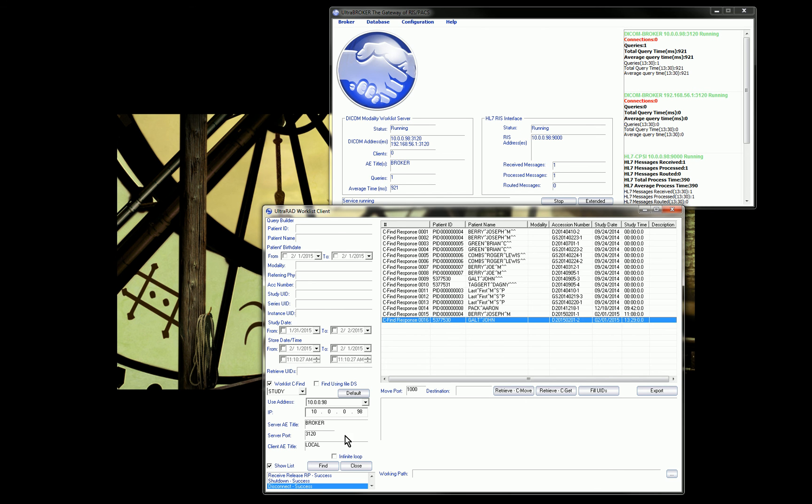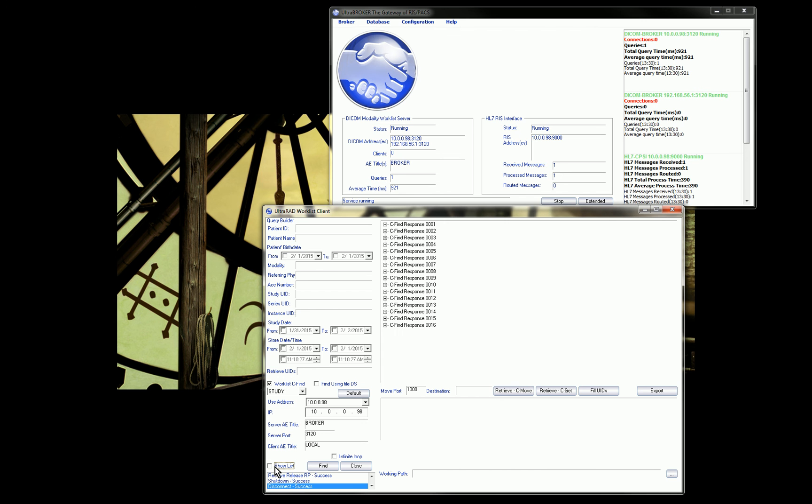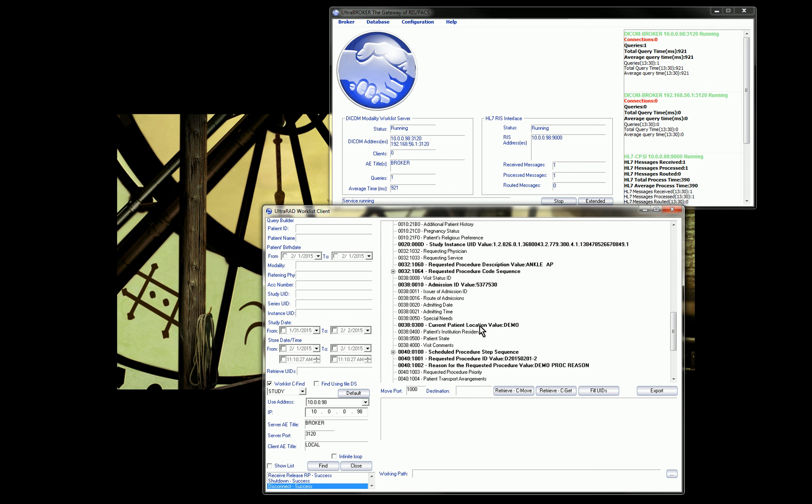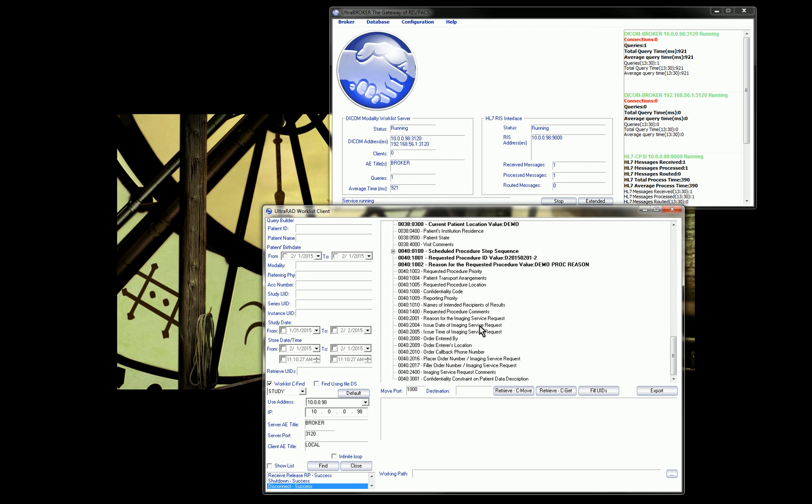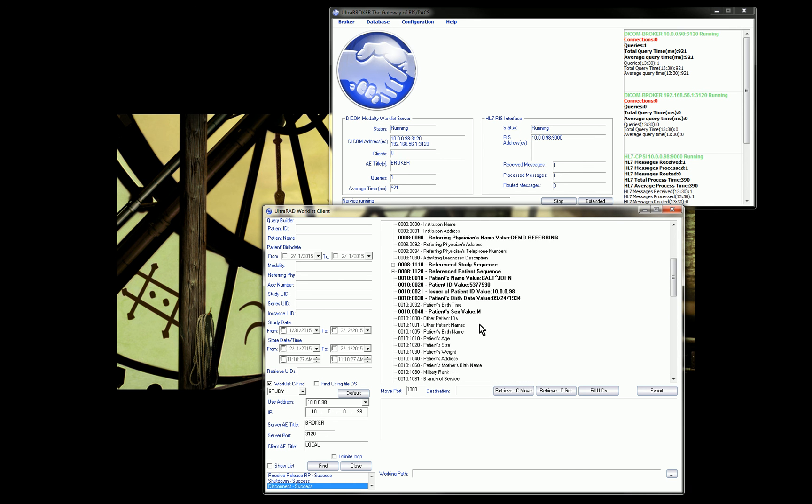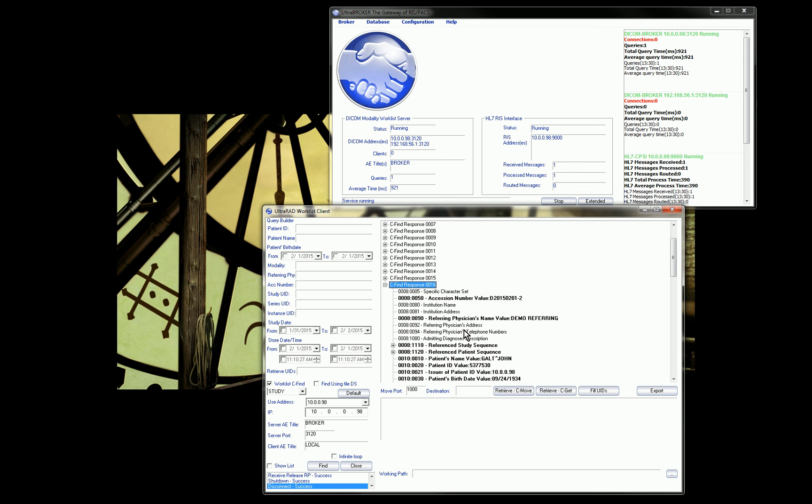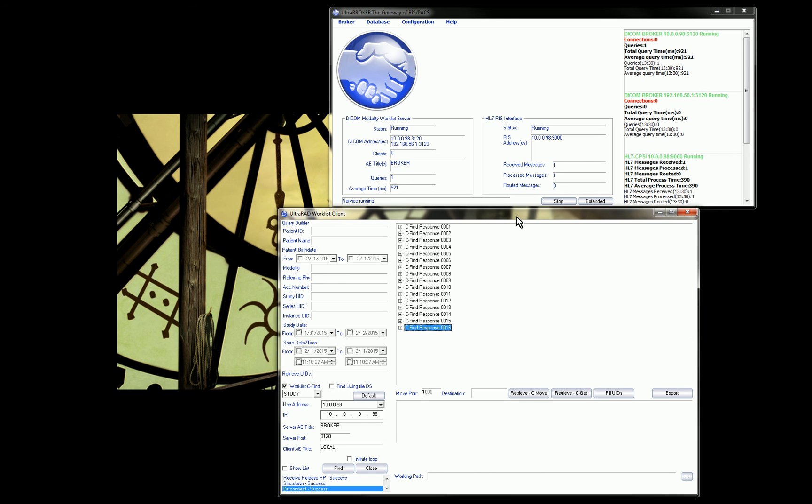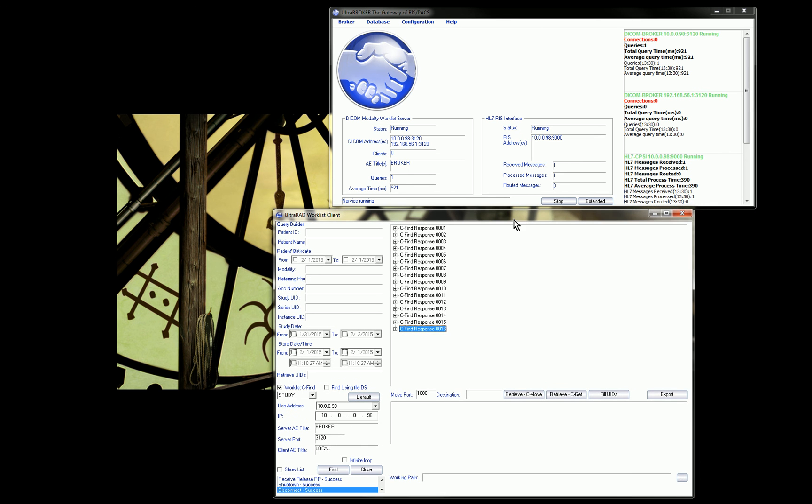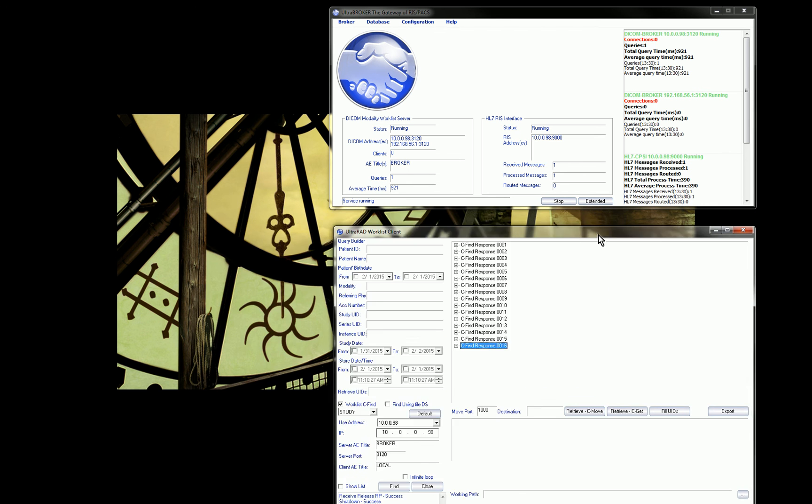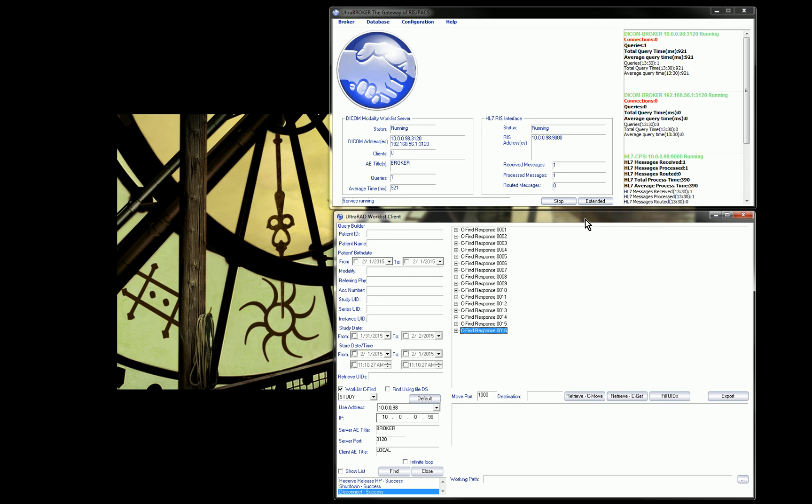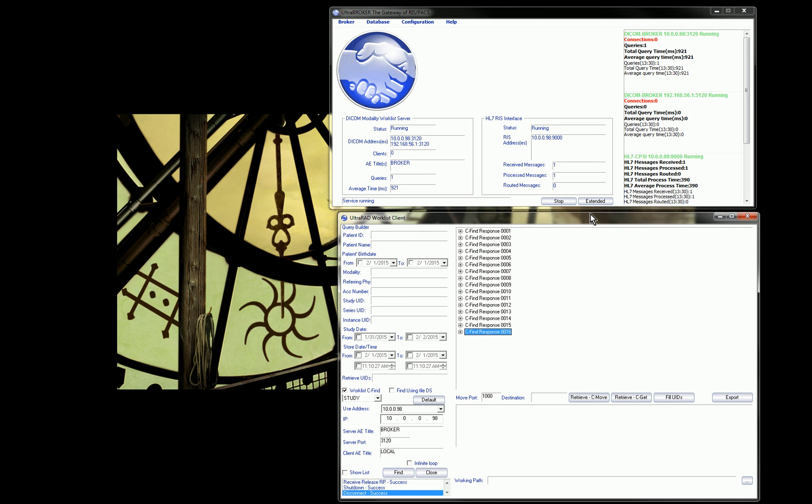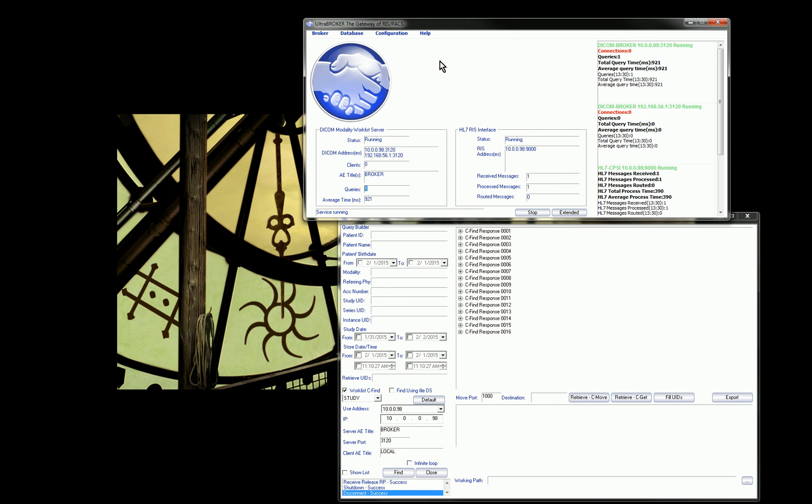With this little tool, I could also look at the actual tags that were returned. Here's the actual DICOM tags that were sent in that query response. We do have quite a bit of troubleshooting tools included with the broker, which are especially helpful for a lot of the non-radiology modalities where things might be non-standard.